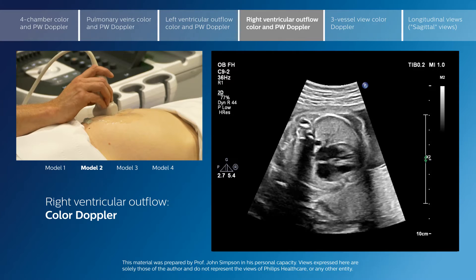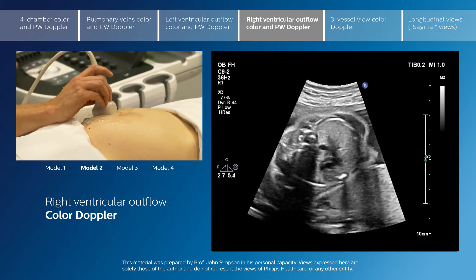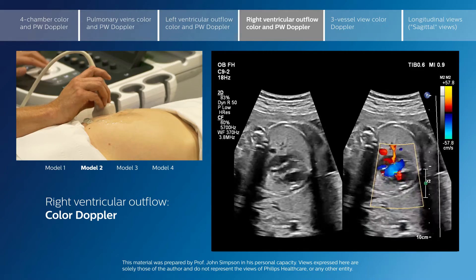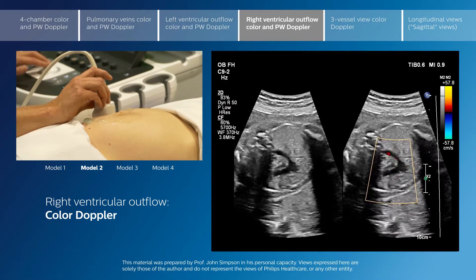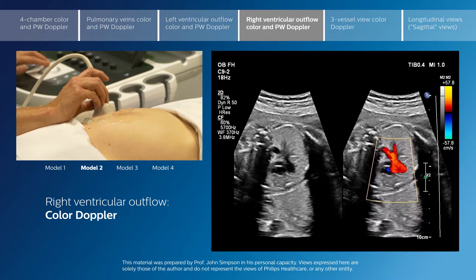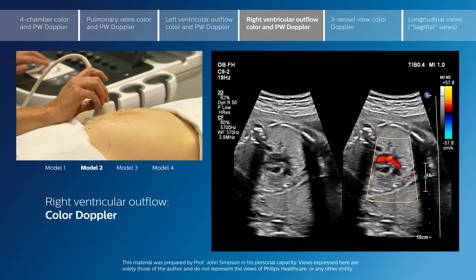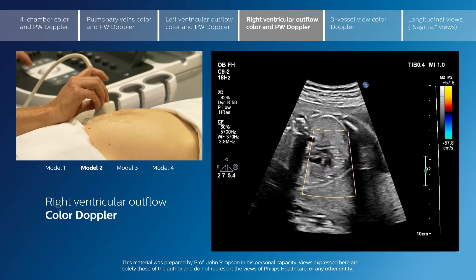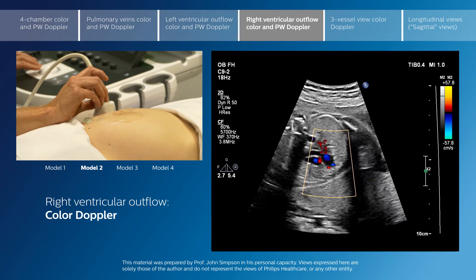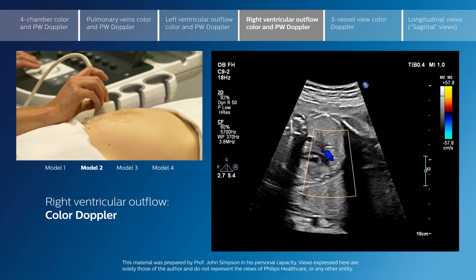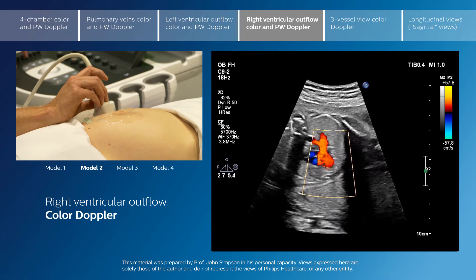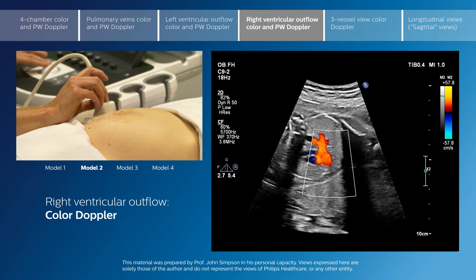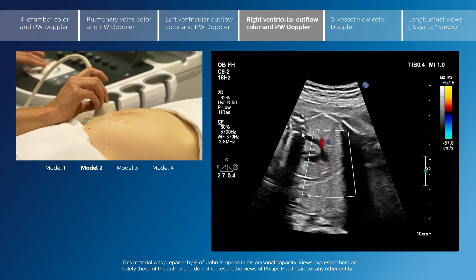I can turn my probe around and now get into an orientation where the view from the pulmonary artery as it comes straight up towards the spine will make this a good angle to Doppler the pulmonary arteries. I'm going to take us off the color compare mode and we can see the bifurcating pulmonary artery coming straight up towards us here with the spine orientated to the top of the screen.